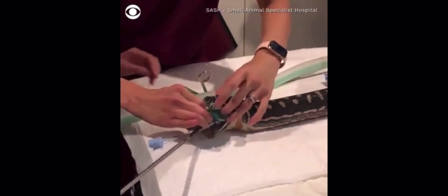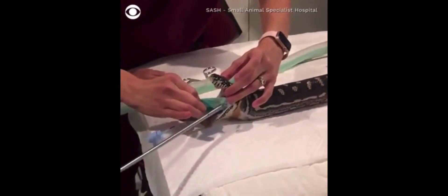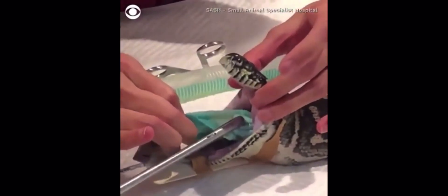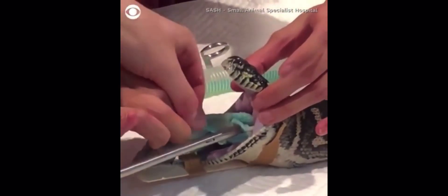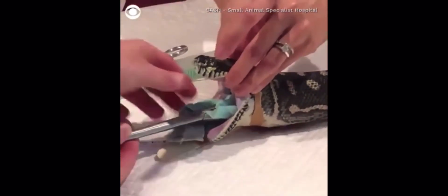Can you hold the snake's mouth? Do you want to pull it out? Just let go of it, I think. Okay, that's fine. Just hold that together. Wow. Wow.